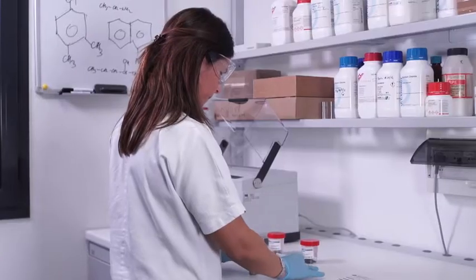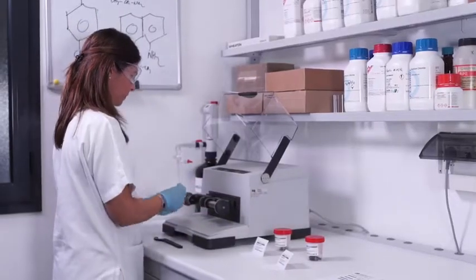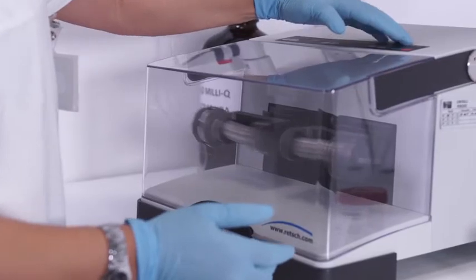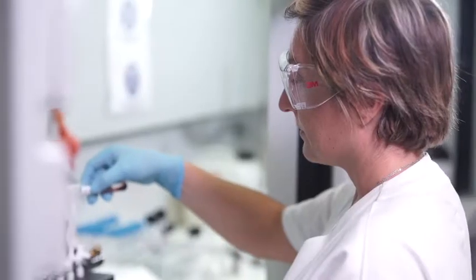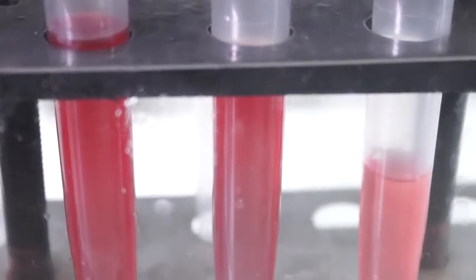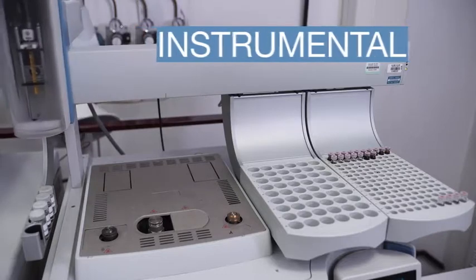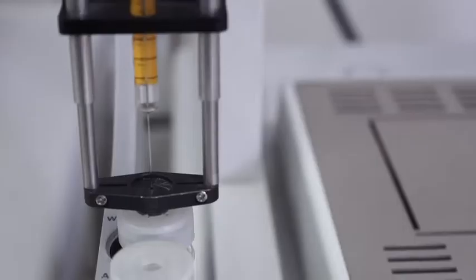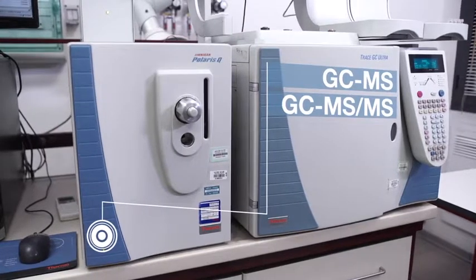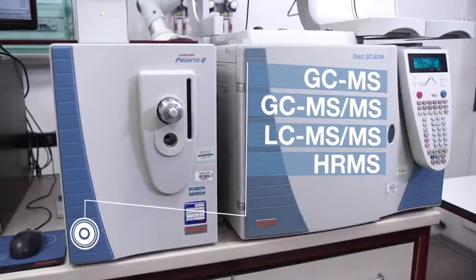The analytical workflow begins with sample preparation. Hair samples are decontaminated and pulverized, and analytes extracted with solvent mixtures. After the addition of internal standards, blood, urine, and hair samples are extracted using liquid extraction or solid phase extraction. Identification and quantification of drugs and their metabolites are mainly performed by GC-MS, GC-MS/MS, LC-MS/MS, and high-res MS.